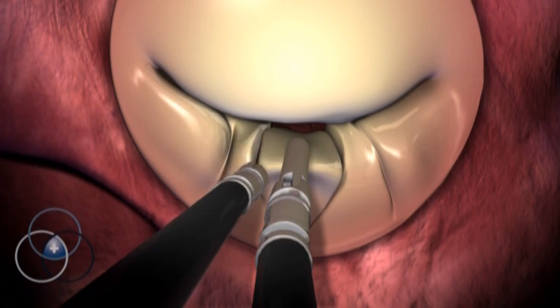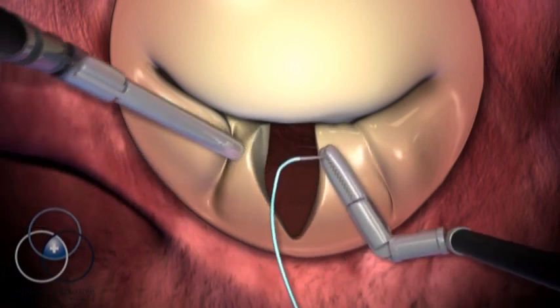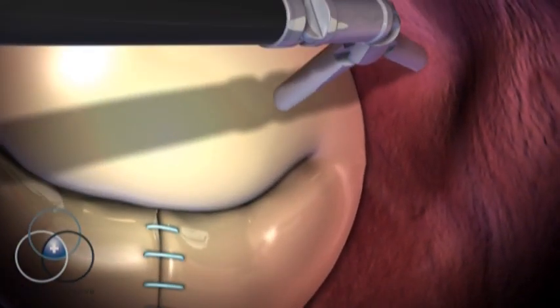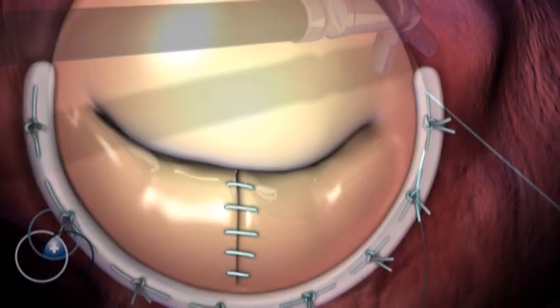The surgeon quickly and carefully repairs the leaflets of the valve. Once the leaflets have been repaired, the surgeon reinforces the support of the valve by using a band made out of special material. This process is much like reinforcing the frame of a door.